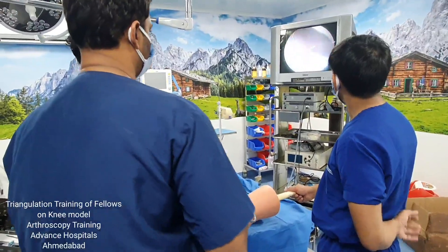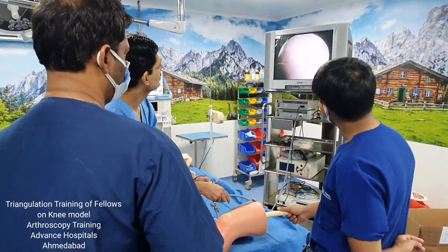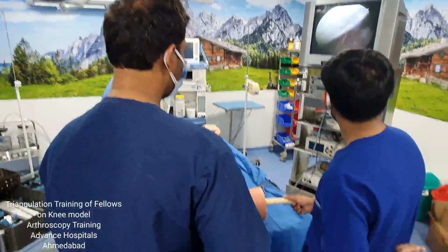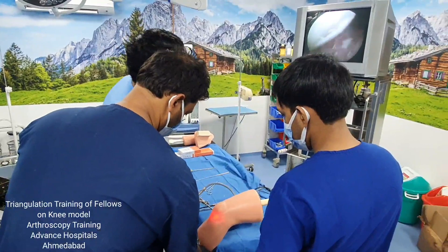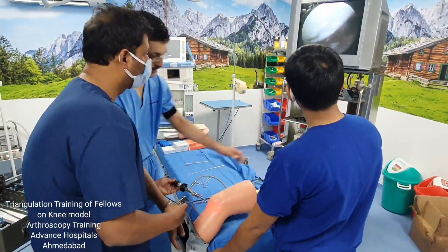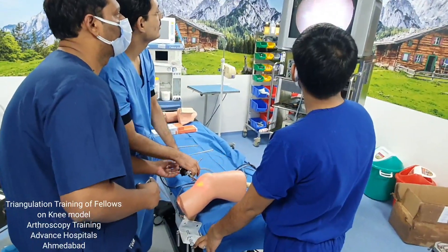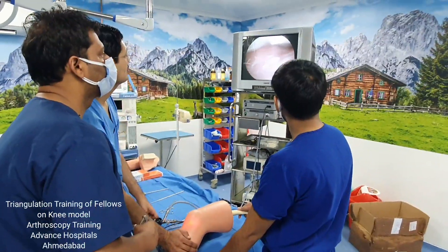Now here you can see the notch view. This is your condyle — you go right here and this is your notch view. You can see the notch view of the knee clearly here.